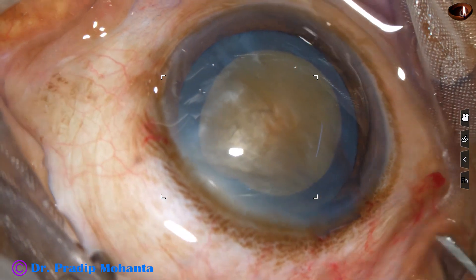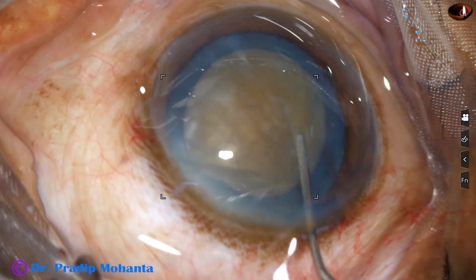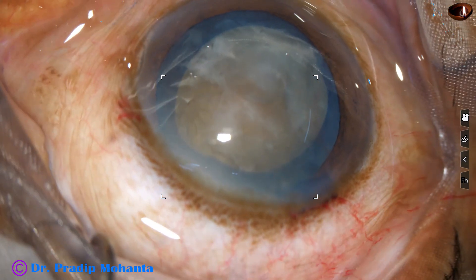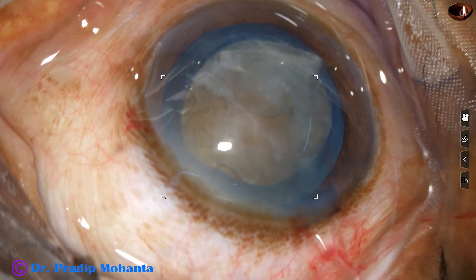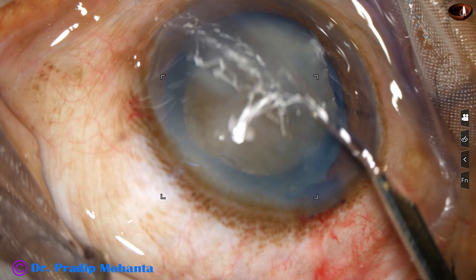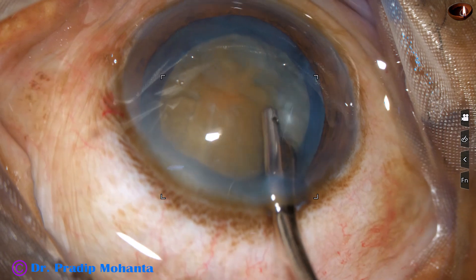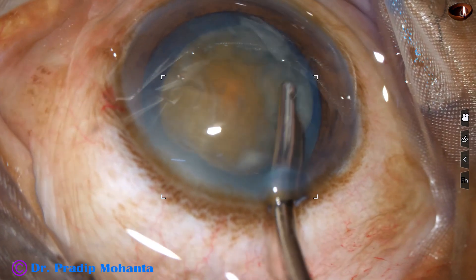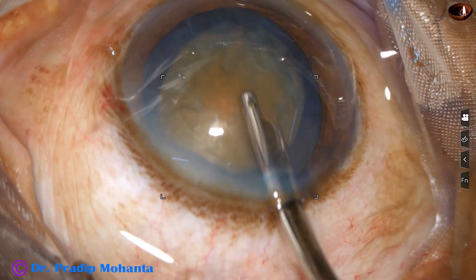Hydrodissection is done. As I do hydrodissection, some loose cortex comes out. In this case, I am going to use a Simcoe cannula first to remove this cortex so that I can see clearly. The Simcoe cannula is being used to aspirate the loose cortex. Now visibility is good.